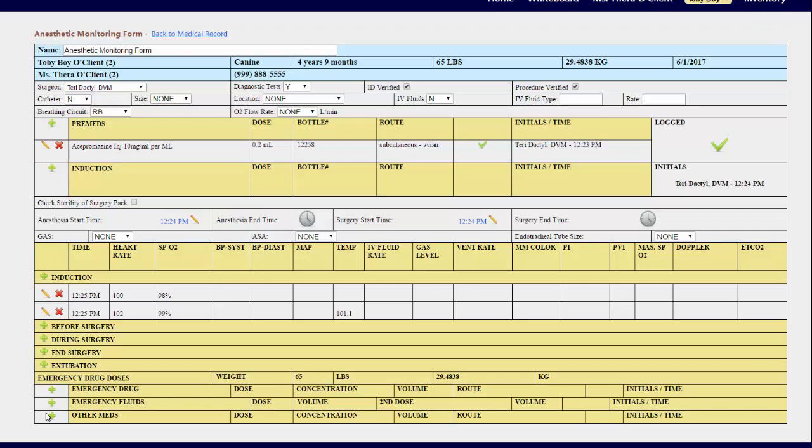Once you have completed the form, you do not need to save. As you can see, some of those sections can be edited after surgery, but if they have already been initiated or logged off on, they will need to be re-initiated. This form is designed to be used during surgery. However, the edit pencils allow you to change the time so that you can fill out the form post-surgery.